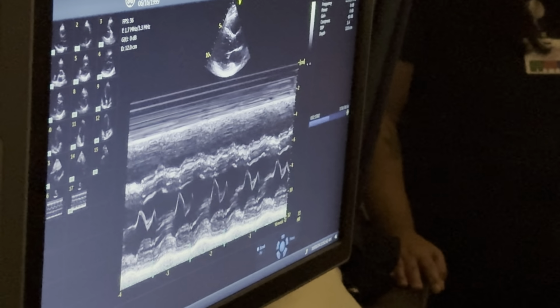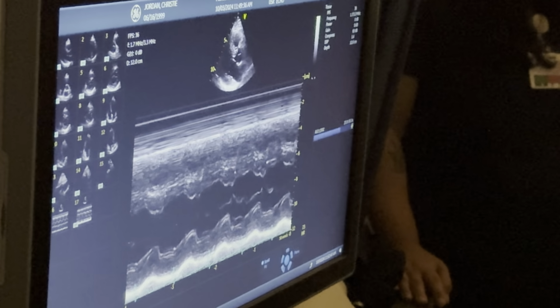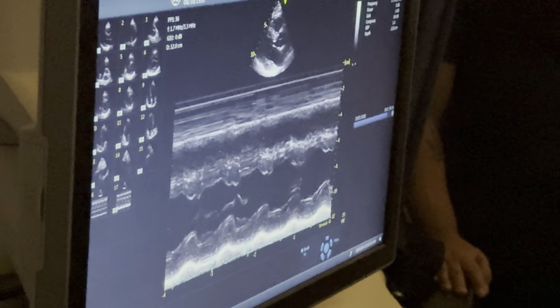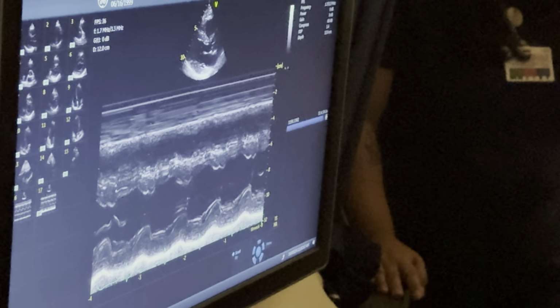Measure off. If you hit freeze during any of this time, it's going to unfreeze all of these images that you've saved. I've done that on accident. You just have to capture it again. So don't be sitting and panicking.